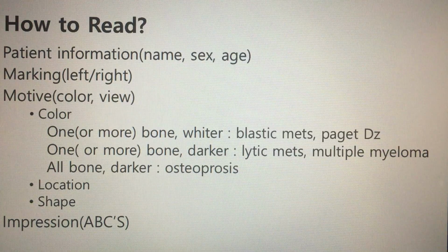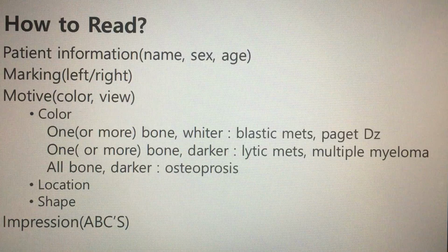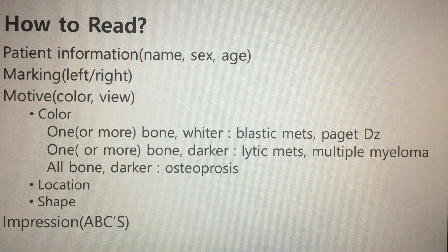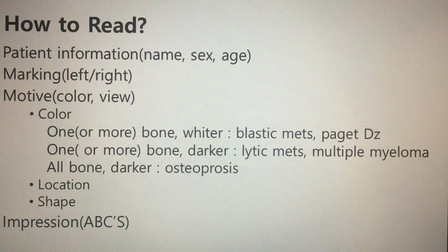How would you assess an X-ray if the patient had taken one to confirm the diagnosis? In the image, we should check patient information and positional marking. Then we could check color, location, and shape of the region for clinical radiologic pathologies. Once you get used to seeing normal X-rays, you will learn more about regions.